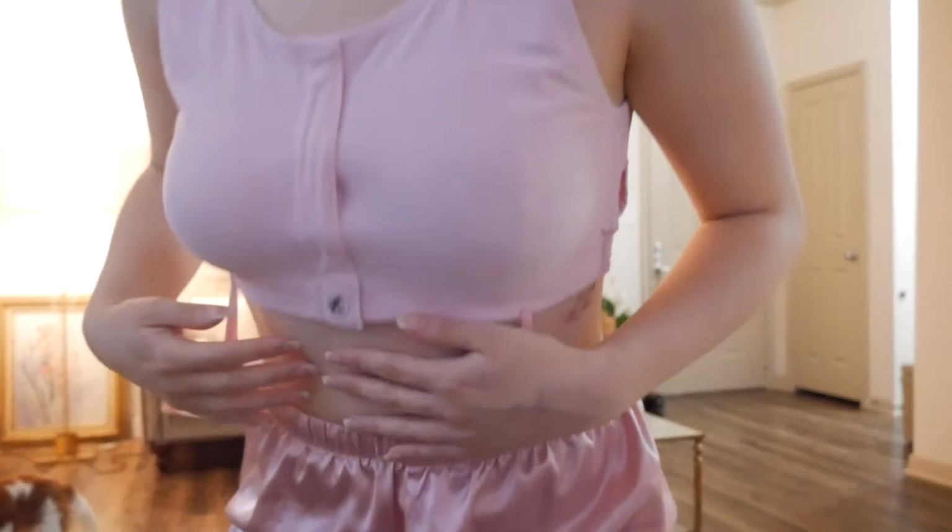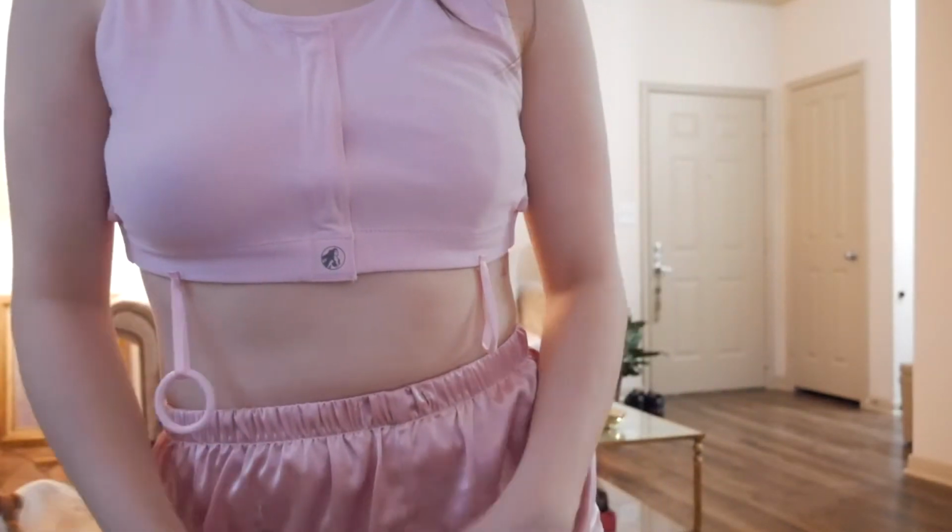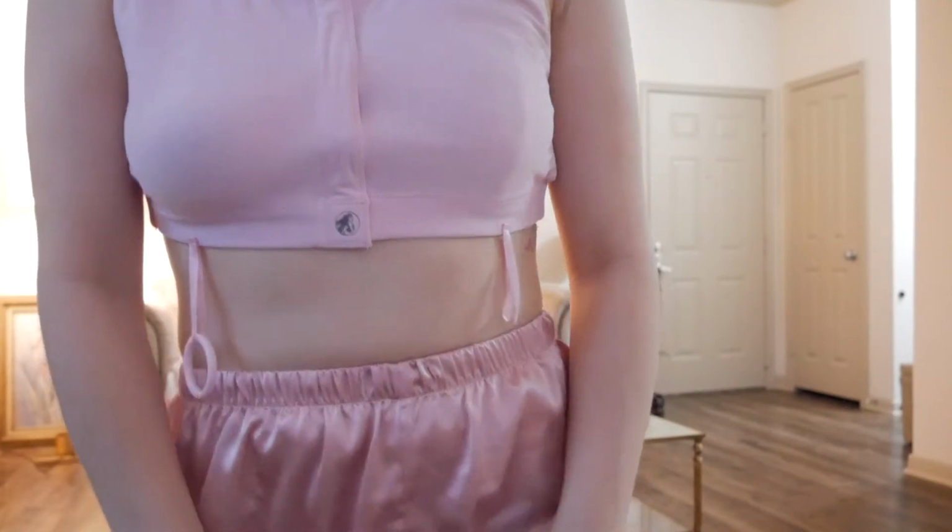But I want to show you what they actually look like. From the front, they look like this, and this is with one fill, which isn't super off, but you can kind of see that mine is like a natural slope. This one is like a perfect smaller chest. It does have a little ridges just because that is the shape of the expander. I would say that the expander definitely feels like a grapefruit. Some areas are soft, but then some other areas, it's hard.